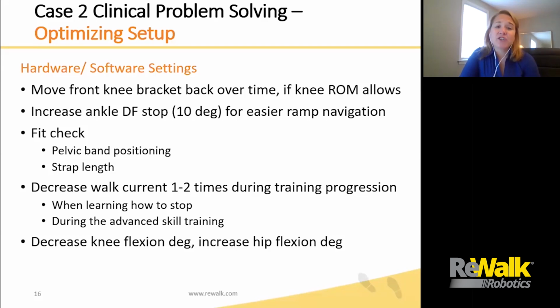Just ensure in general that the fit is still good, right? These patients are going to experience a lot of physiologic changes from training in the ReWalk. Even after a short time, they potentially are going to notice changes in their weight and their body mass. So their pelvic band, potentially they could be ready for a smaller size pelvic band. Strapping could change. So just be always assessing.